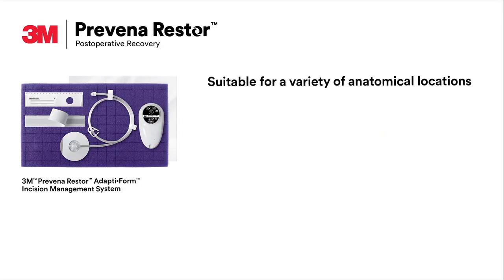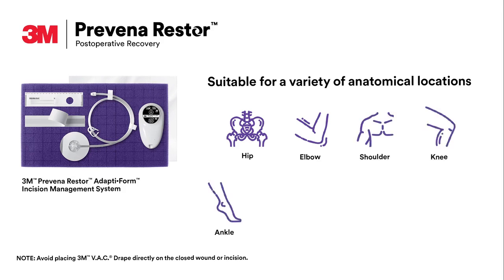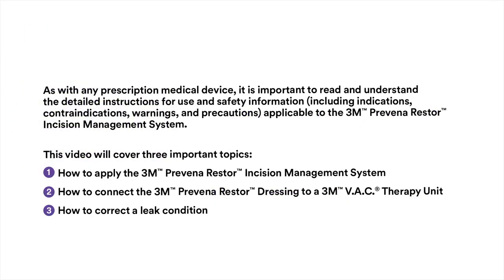This video demonstrates two application examples for the Prevena Restor Adaptiform dressing. The Prevena Restor system can be applied over most sutured or stapled incisions and is suitable for a variety of anatomical locations. First, let's cover some important safety information.